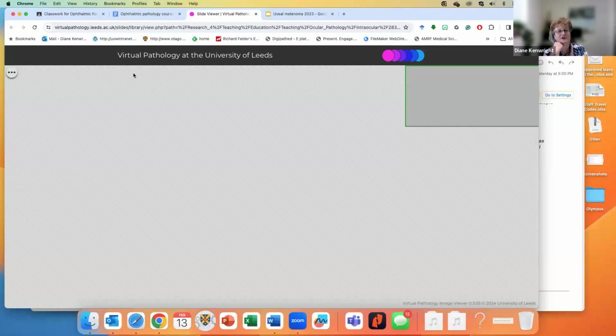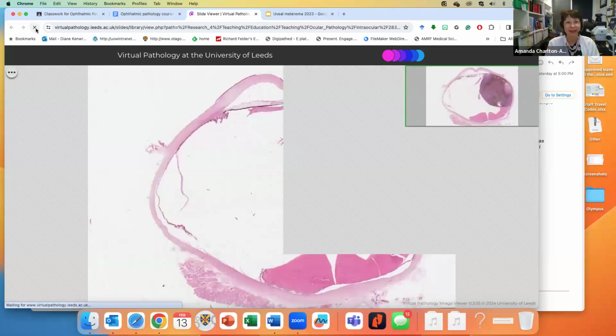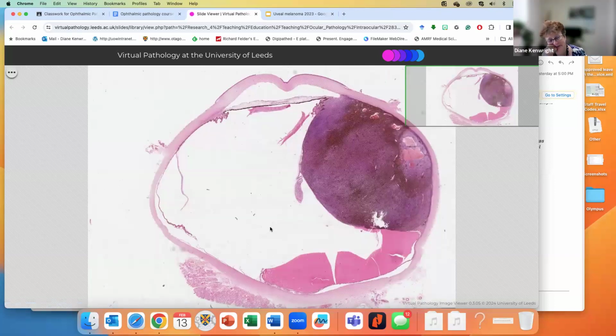Great. All right, so some more on vascular loops and vascular networks. And perineural invasion.